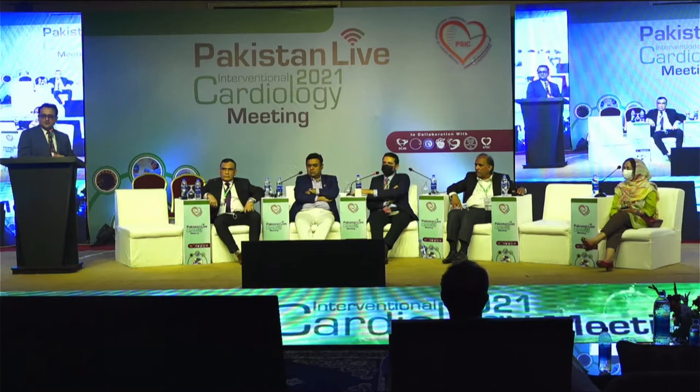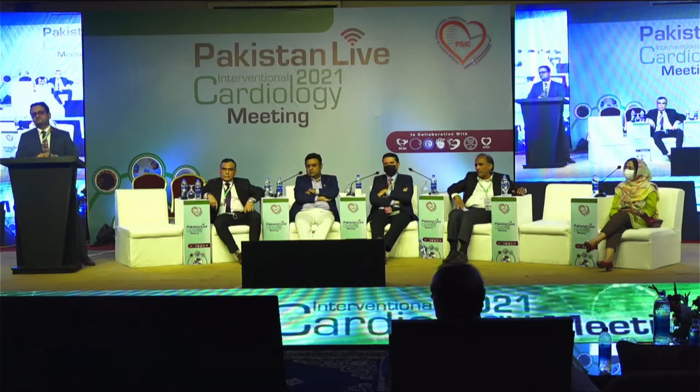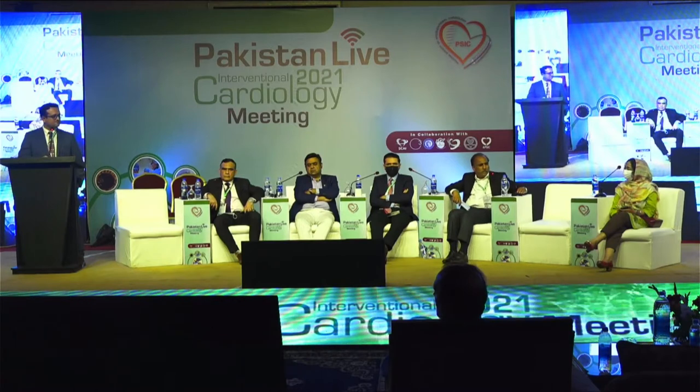I think he wanted to know, with provisional stenting, which approach you use, like 1, 2, or 3 in your practice? I just prefer the one stent approach, Bashir. If there's very little disease in the side branch, usually just one stent approach, and I don't usually do a kissing balloon inflation. If I'm worried about the opening to the circumflex, I do a POT and side repot.